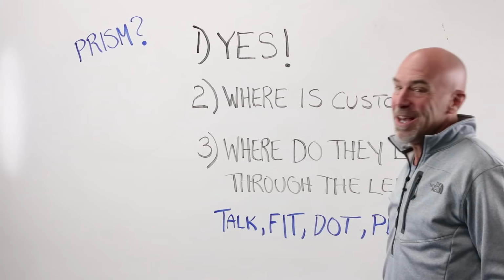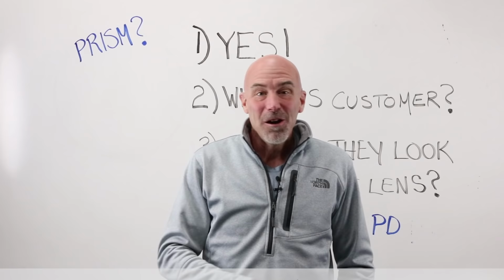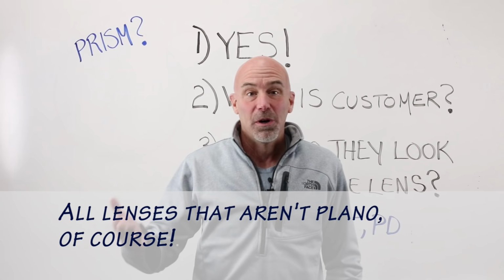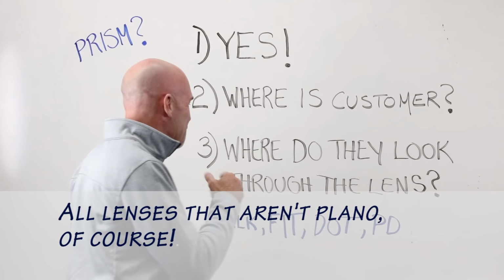Always, okay? 100% safe. All glasses are made from lenses. Lenses are prisms. Every single lens has the potential to produce prism depending on where it's worn. So every single pair of glasses on the planet has the potential to have prism, shall we say. So your first answer is always, yeah.